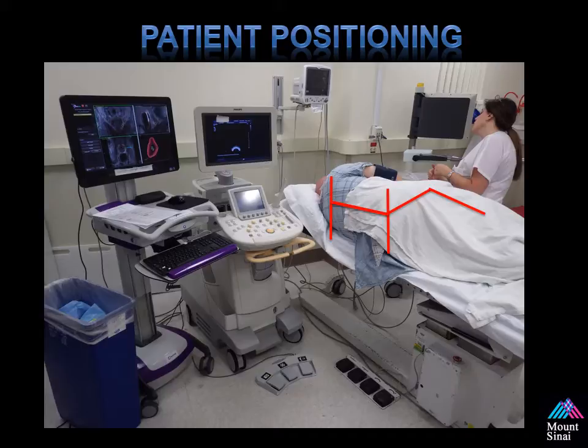The patient is placed in the left lateral decubitus position. Notice how the shoulders, hips, and knees are all squared up. This allows for easy orientation, as well as the machine seems to function better when you're not adjusting for a secondary rotation of the patient.